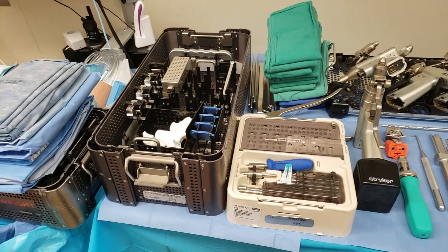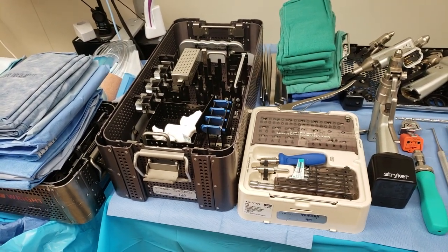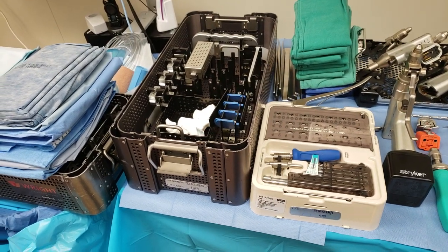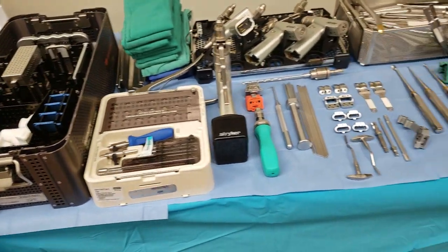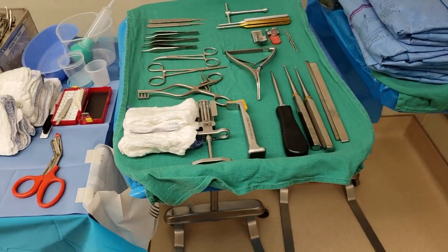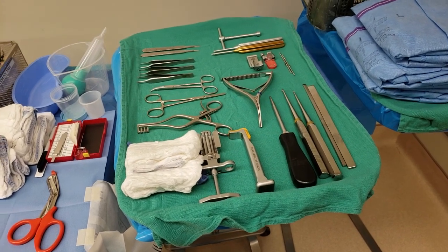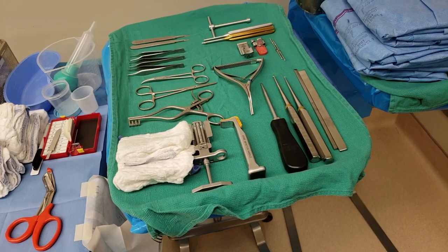So I'm not gonna go over the rep trays because I have no idea what the names are. That's what the rep is for. He will tell you what you need and what you don't need. And so yeah, this is my setup over here. And again, this is not guaranteed. This is just based on what I know and what they used. So your orthopedic or podiatry surgeon might not use the same, but this is what I have so far.